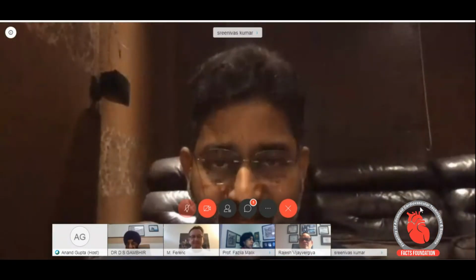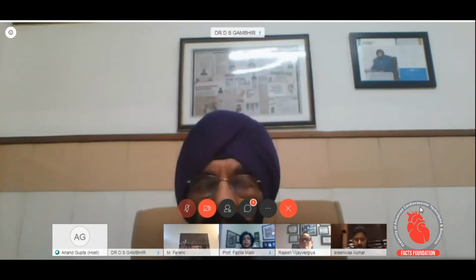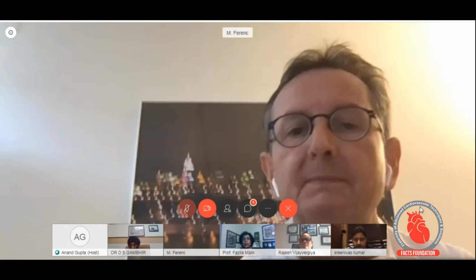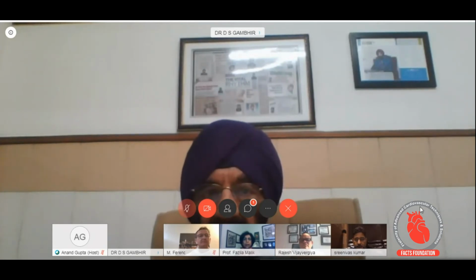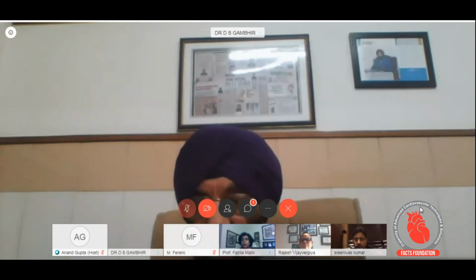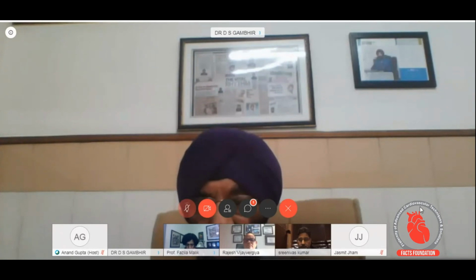No, I just wanted to make 2 or 3 points about the slow flow because there are a lot of young interventional cardiologists in the audience. See, there are 2, 3 things which are often forgotten and can be tried, should be tried, and do help. One is autoperfusion, particularly in the right coronary artery. Many of the people are really not aware of this terminology.